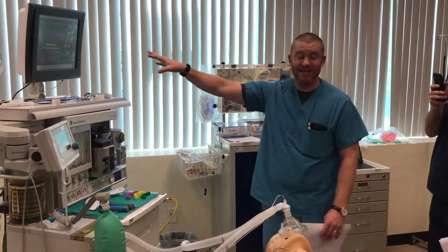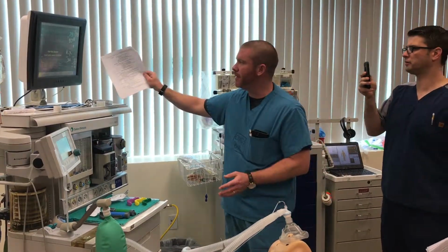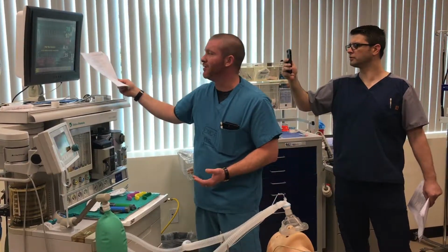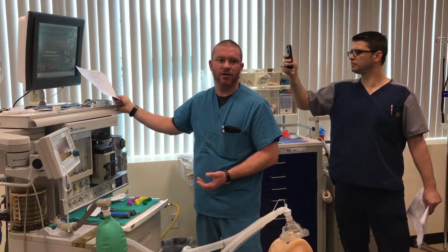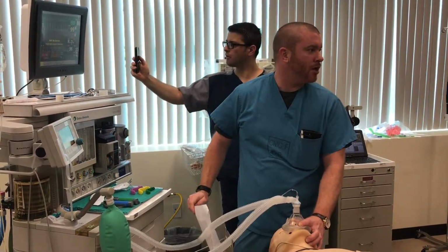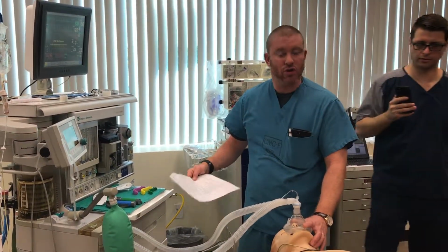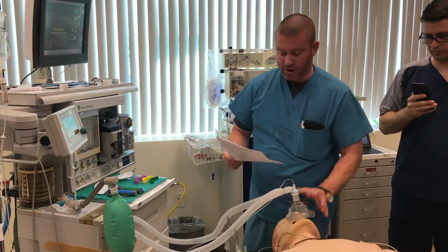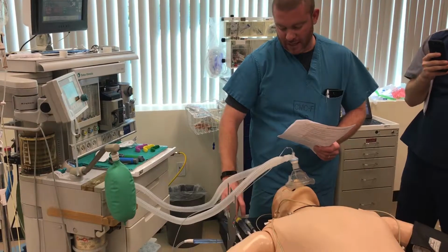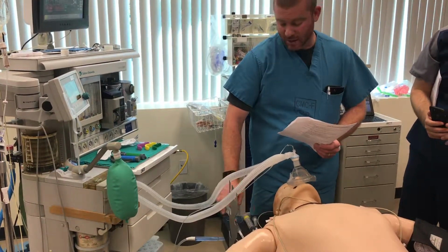So I say that purposely because when you go to do your induction, look up here, take a look at everything. The EKG is not some funky rhythm. We have a good blood pressure, heart rate's good, we have good end-tidal CO2. Make sure you pay attention to this, that they are pre-oxygenated. If not, you'll sit over here and say, I'm just waiting to pre-oxygenate the patient. Once it's at 80%, and you've done your anesthesia timeout, you can now give your drugs. 150 mics of fentanyl. You'll give your 100 milligrams of lidocaine, depending upon weight, 150 to 200 milligrams of Diprivan.